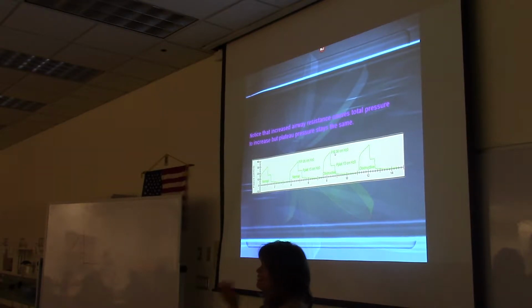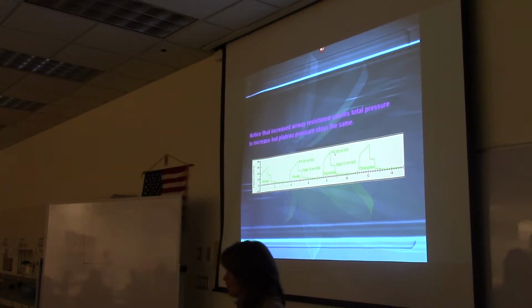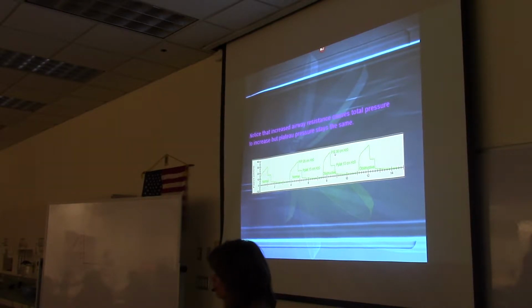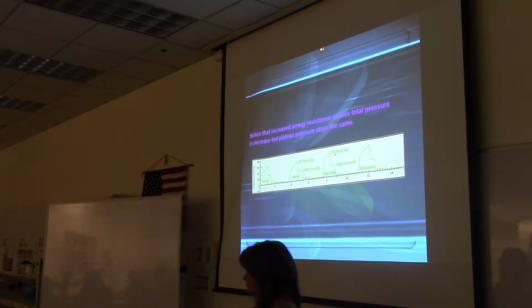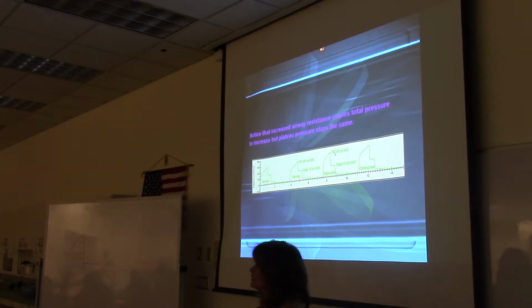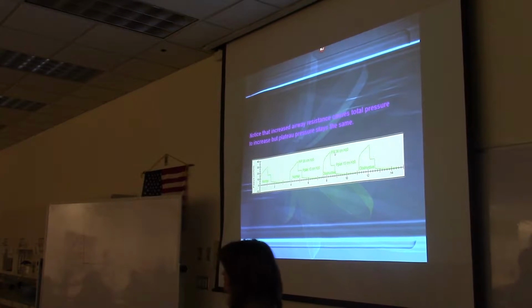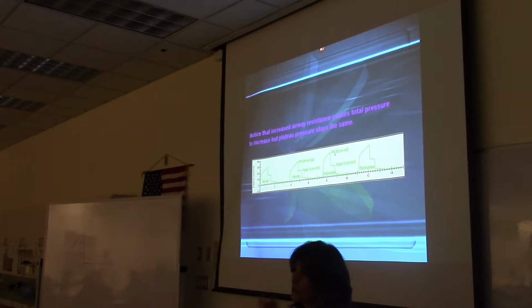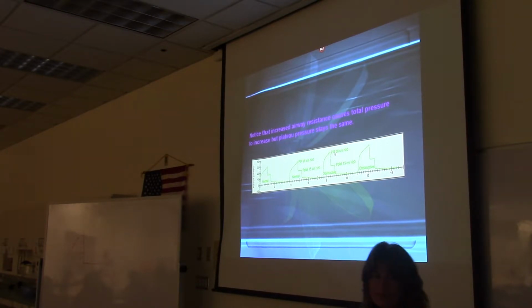Then, if you intubate somebody, even if you use a size 8 ET tube on an adult, and you measure the airway resistance, it increases tenfold. So write this down. Intubated, airway resistance is 6 to 10 centimeters of water per liter per second. And that's normal for intubated. Yes. So that's normal airway resistance once they're intubated. So that's a huge difference, isn't it? Just putting a tube into the trachea and having them breathe through a tube, it creates a lot more airway resistance.